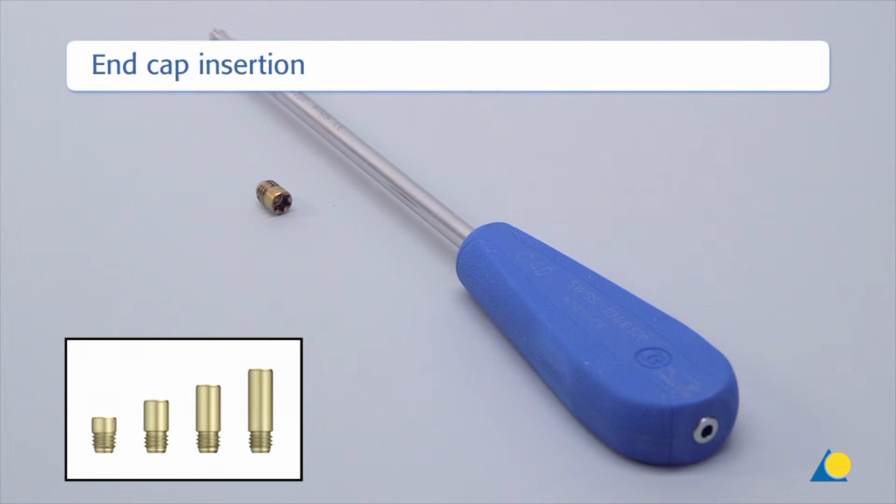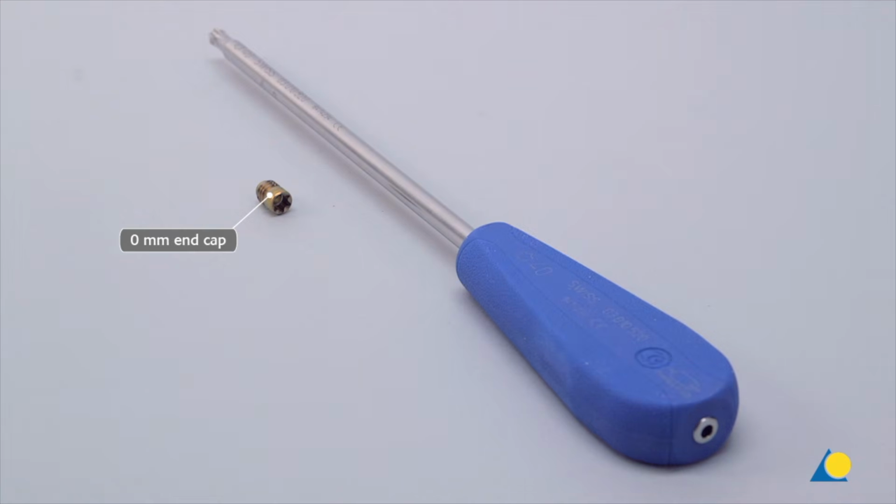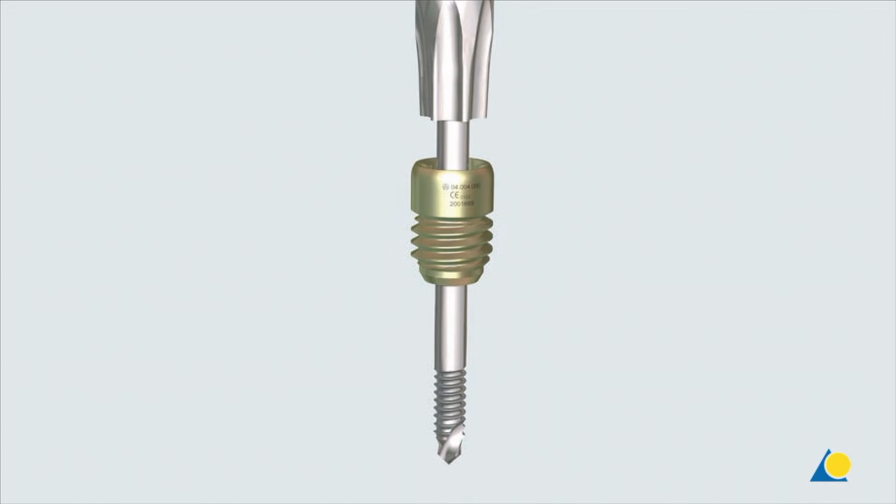End caps for the ETN are available in extension lengths of 0, 5, 10 and 15 mm. In this exercise, the 0 mm end cap will be inserted using the screwdriver star drive T40. The end caps are cannulated for use over a guide wire if necessary. End caps prevent bone growth into the nail, and they extend the nail height if it has been over-inserted.